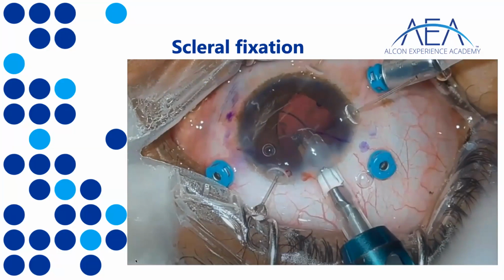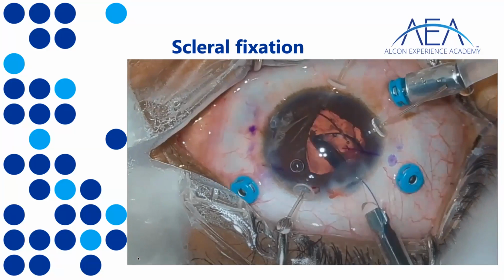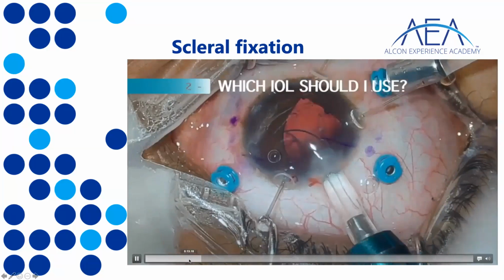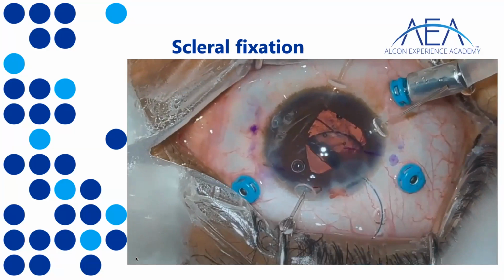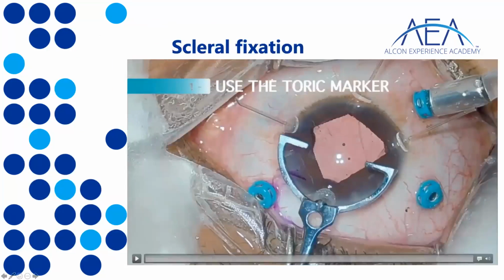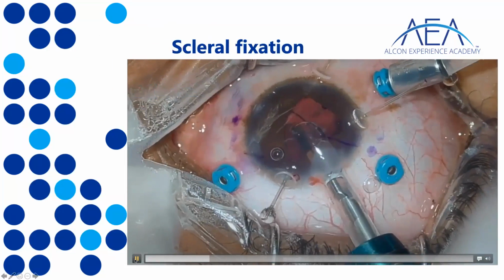In this specific case, the surgeon is using a 3 piece IOL. So the IOL is inserted inside the eye and left hanging on top of the iris. I'll show you again. There you go. So at this stage, you have to create your tunnel.